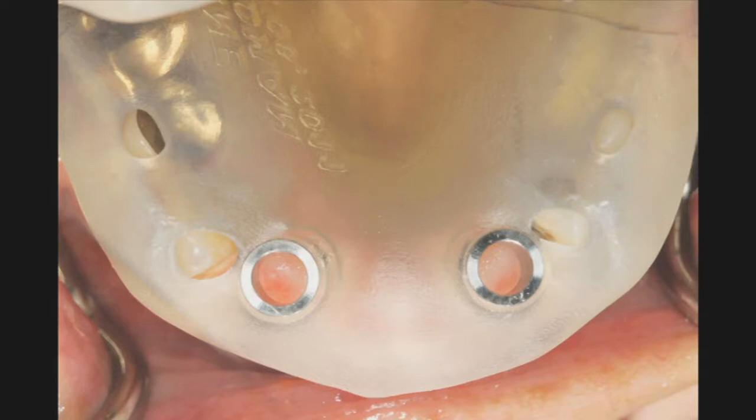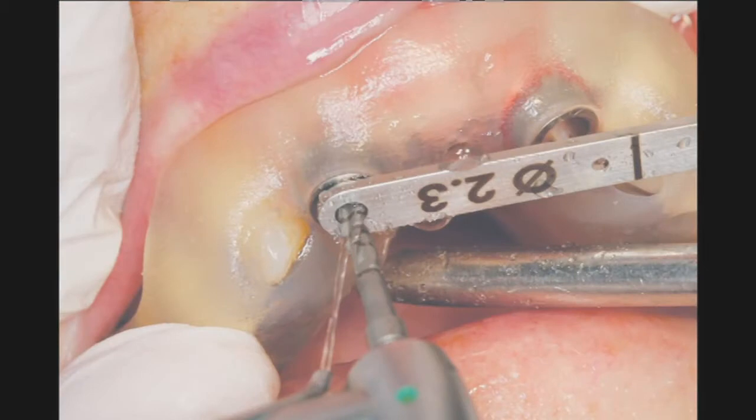Now remember, we virtually placed the implant, so we know the type, size, and shape of implant that we're going to place, as well as the brand. And so this surgical guide will allow us to predictably place the implant in ideal position. This will be a flapless procedure.